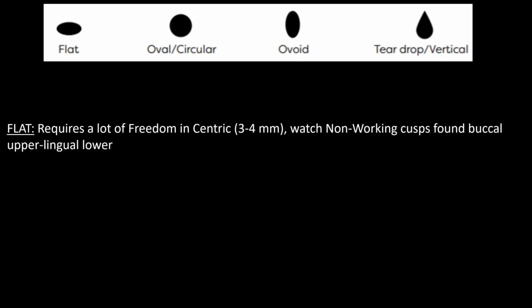You take that little onion paper and you're checking all of those little cusps to make sure they're all touching, and everything that school taught me. Put it back in. Oh, Mr. Smith, everything looks good technically. Comes back, oh, it's still loose and it's jumping around. Well, that was what was going on.